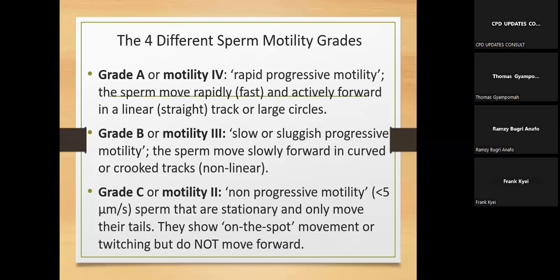So as much as possible, if you can, warm your slides and cover slips so that it doesn't create differentials in the temperatures. That would be very well appreciated.